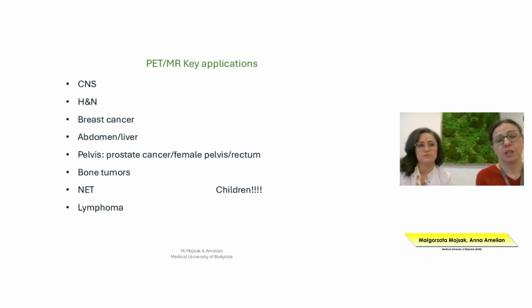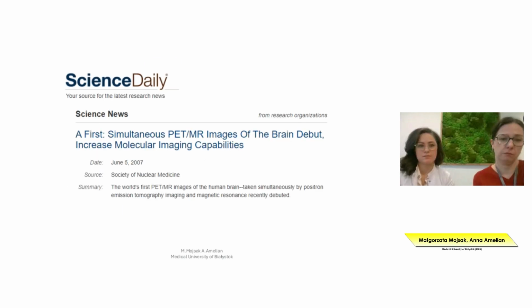And in case of lymphoma patients, these are mainly young patients. And as we know, in case of lymphoma patients, expert groups advise that PET-MR technology should be applied.